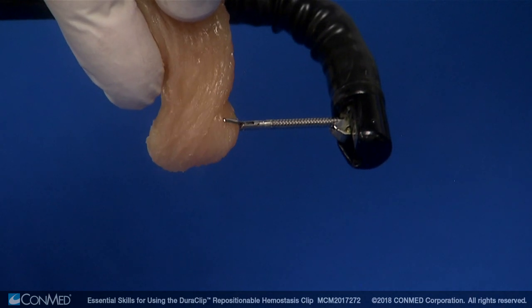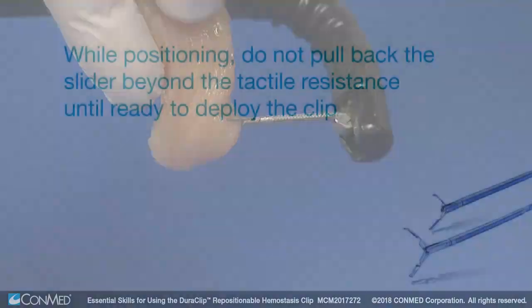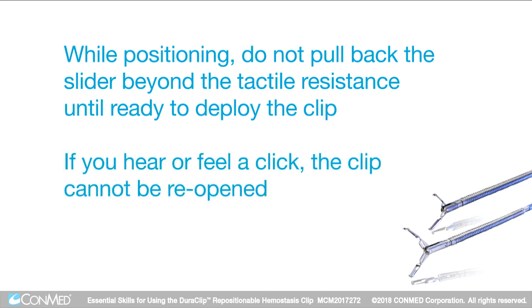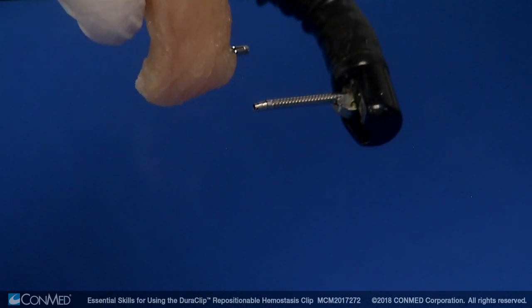If not in the desired position, the clip may be reopened and repositioned as many times as required. While positioning, do not pull back the slider beyond the tactile resistance until ready to deploy the clip. If you hear or feel a click, the clip cannot be reopened. To deploy the clip, continue pulling back the slider beyond the tactile resistance point.